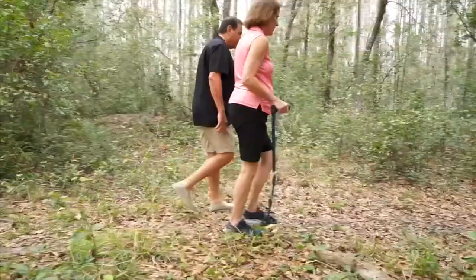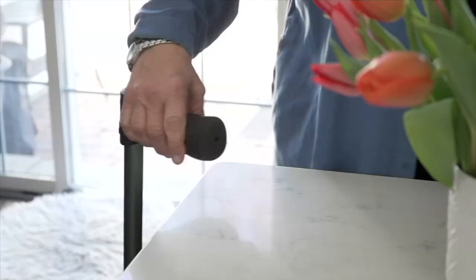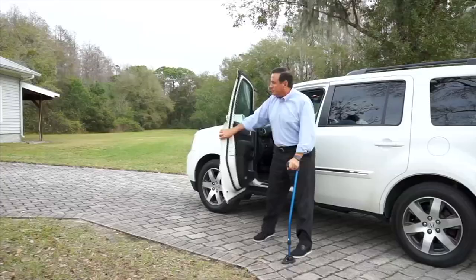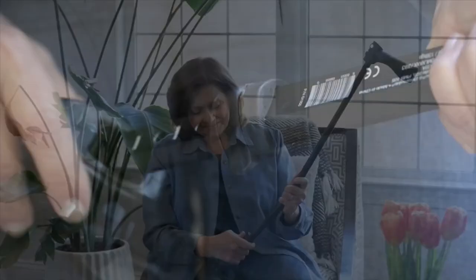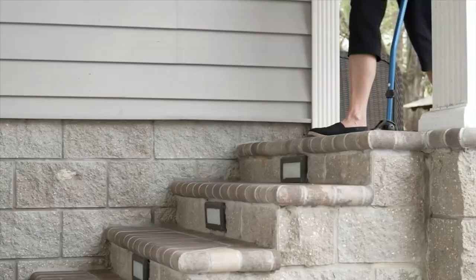If you have some mobility concerns, I want you to see the Swing Cane from Dynamo. There really is nothing else like this in the marketplace today. The gentleman who created it had instant credibility when I met him because he had over a thousand days of his life walking with crutches or a cane, and multiple surgeries to alleviate pain. He knew what it was like to have to walk with equipment that gave you assistance.